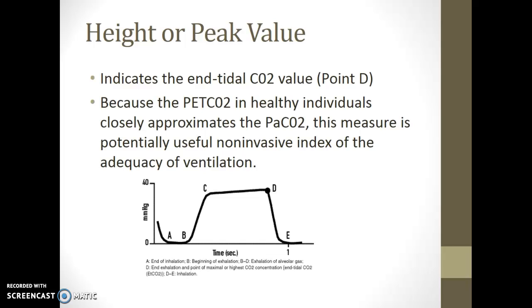So the height or peak indicates the end tidal CO2 value, which is point D on the graph represented below. Because the partial pressure of end tidal carbon dioxide in healthy individuals closely approximates the partial pressure of arterial carbon dioxide, this measure is a potentially useful non-invasive index of the adequacy of ventilation. So instead of having to draw blood gases all the time, we can use capnography as a trending tool to see if the carbon dioxide levels are increasing or decreasing over a period of time.